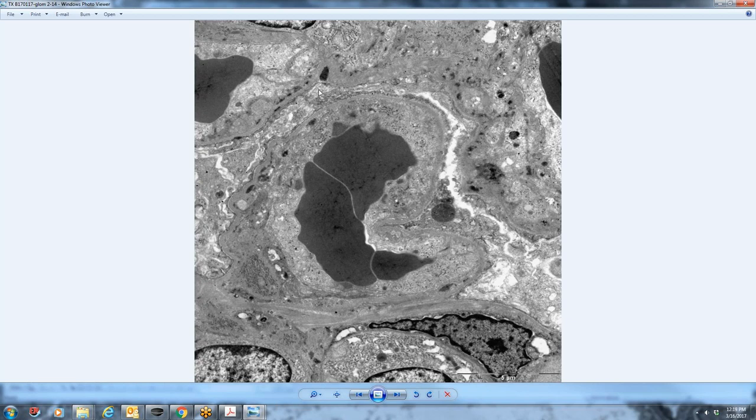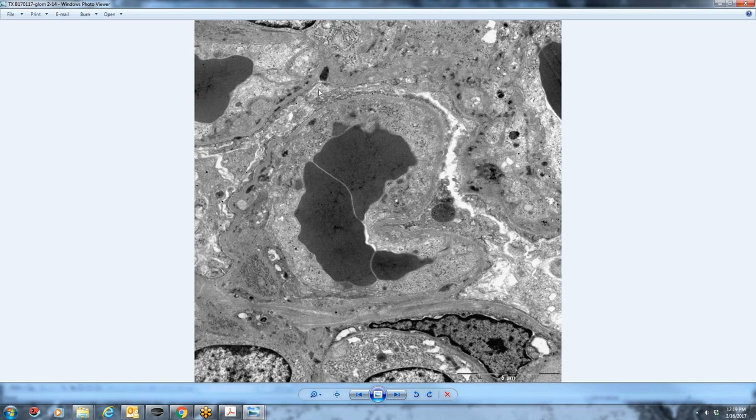You'll see tons of polys, tons of cellular debris, like what we're seeing in this particular case. So even though the deposits are kind of sitting far away from the capillary lumen, I think the fact that there's so much complement there is what's bringing all of these inflammatory cells into the capillary loops. So an unusual GN with evidence of some subendothelial deposits but then having C3 dominant humps on the electron microscopy.